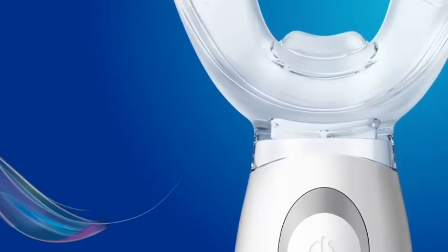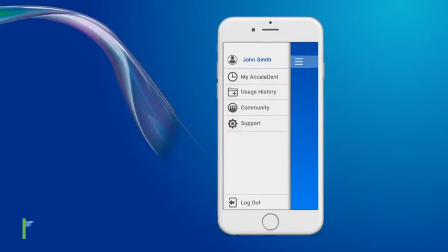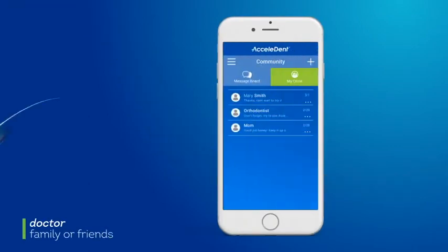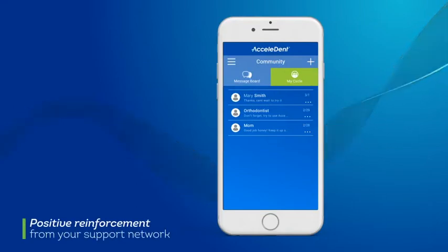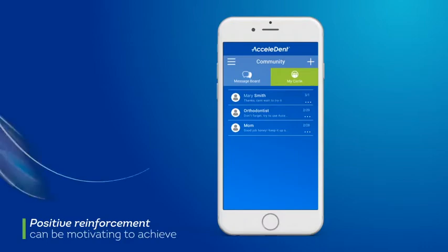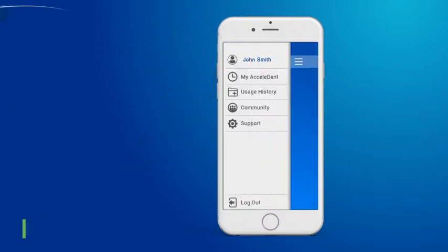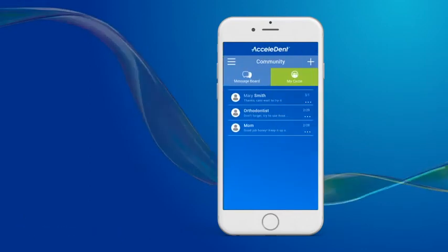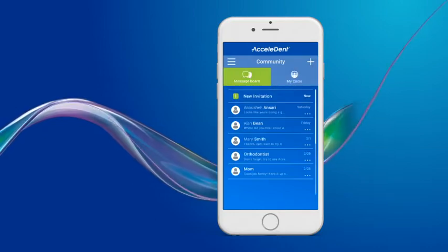Now that your Accelident Optima is paired, you will be able to use all the wonderful features of the app. Please start by inviting your doctor to connect with you and any family or friends with whom you would like to share your progress. Positive reinforcement from your support network can be motivating to achieve excellent usage goals. To add observers, tap on the Community tab in your app menu. You, your doctor, and other observers can send and accept invitations to connect through the app.